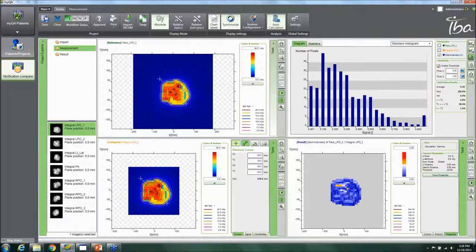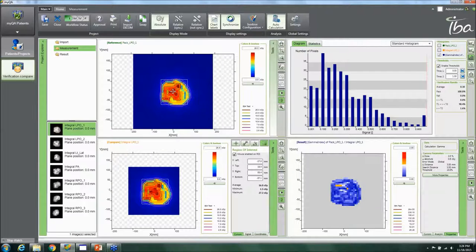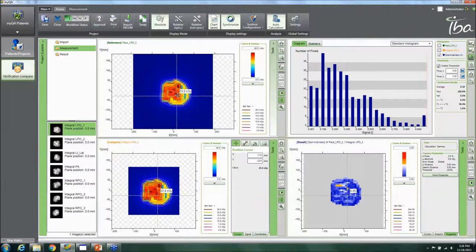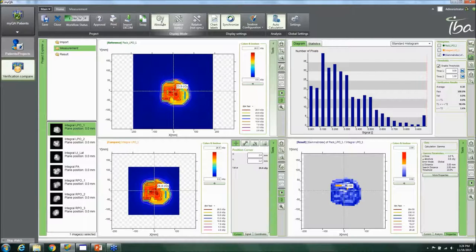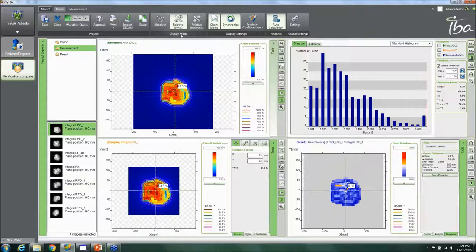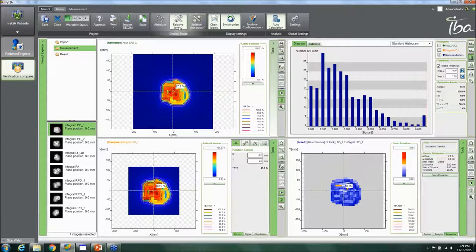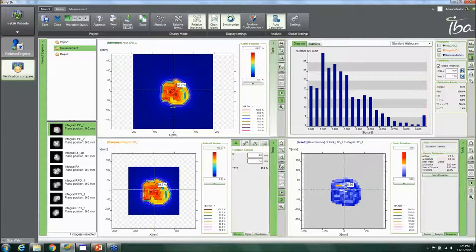Additional tools include a distance cursor, distance tools, angle tools, and a region of interest tool. The synchronize function synchronizes the two panels so you're always looking at the same location. Chart labels can be toggled on and off. You can view data in absolute mode — showing actual dose — or relative synced mode showing percentage dose, or relative not-synced mode where each panel independently normalizes to its own maximum.